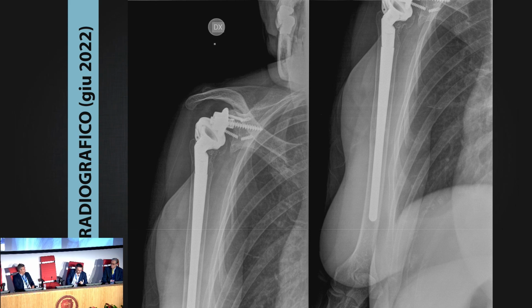Thank you. Dr. Antuna, what is your position with this patient who is painful, she has discomfort, but she's not terrible? Yeah, she will be, and I know she will be. So for me, this is a case in which I would try to convince her that she needs something done, even though this is a tremendous operation, because you're going to be worse soon. If it was the opposite, if she was painless, no pain at all, and the motion was limited, then I would probably wait. But if she's painful and there are these radiographic signs of infection, the chances of improving are, in my mind, none. All the blood tests for infection were completely negative.